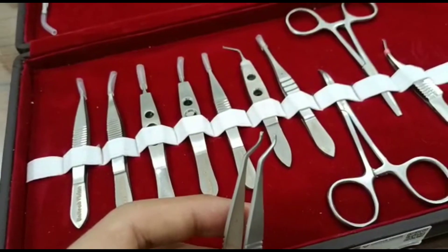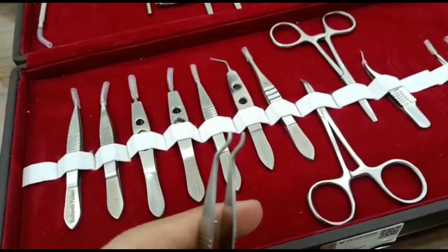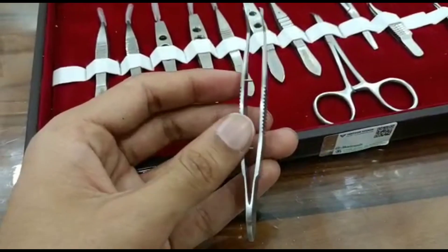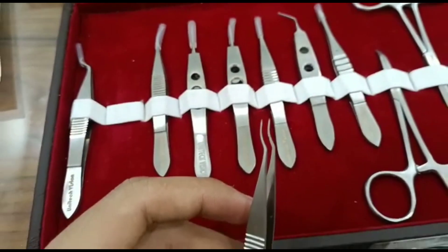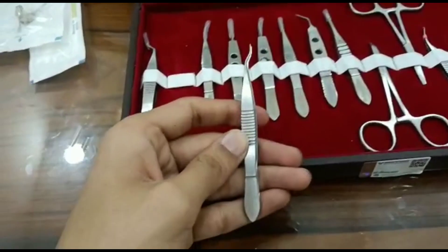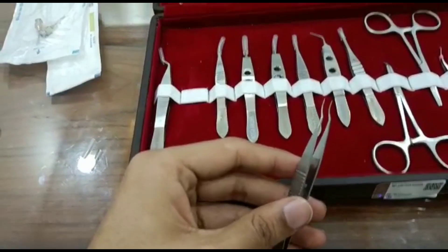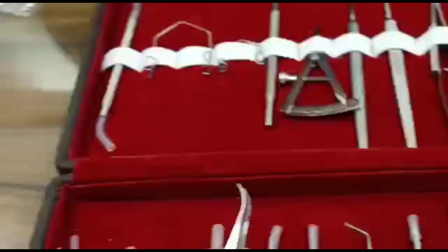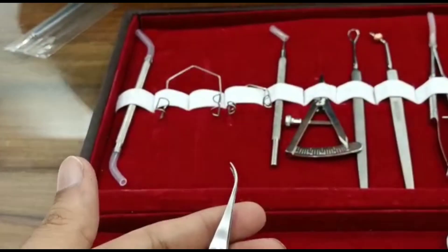Superior rectus forcep. Limbal forcep. Kurd dressing forcep.